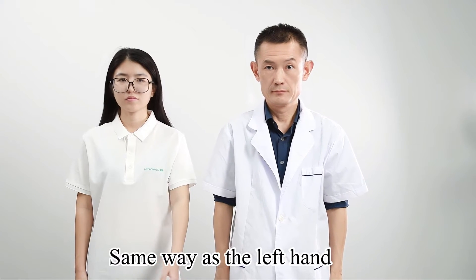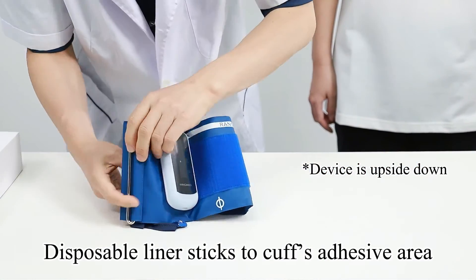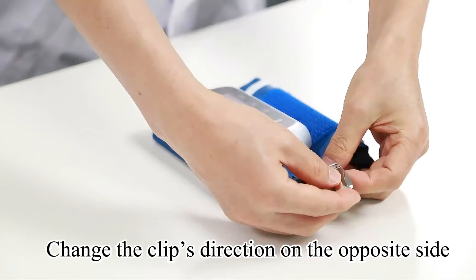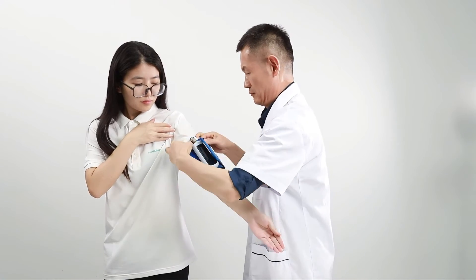For the right hand, the setup is the same as the left hand, but the device is upside down. The disposable liner sticks to the cuff's adhesive area, and the clip's direction is changed to the opposite side.